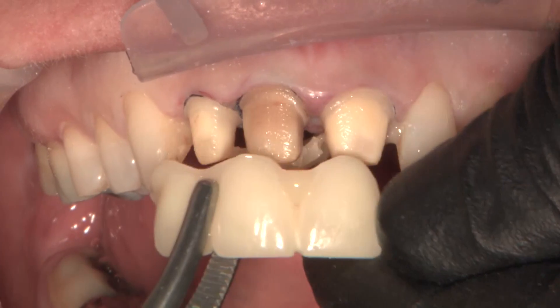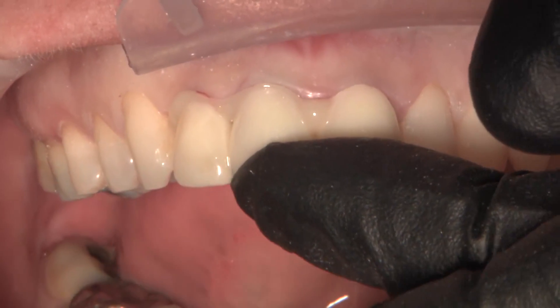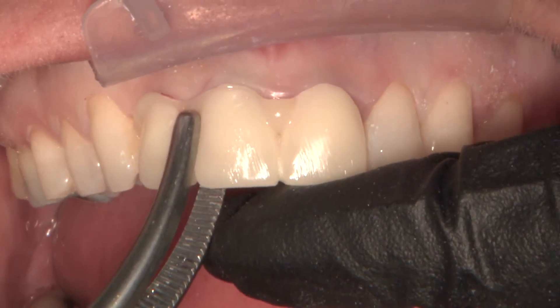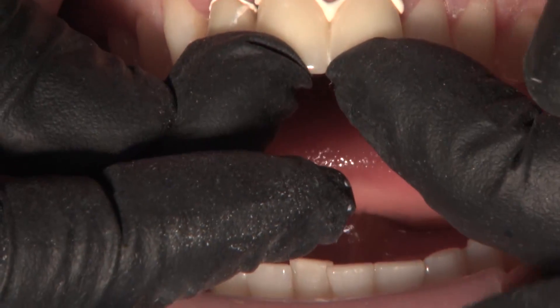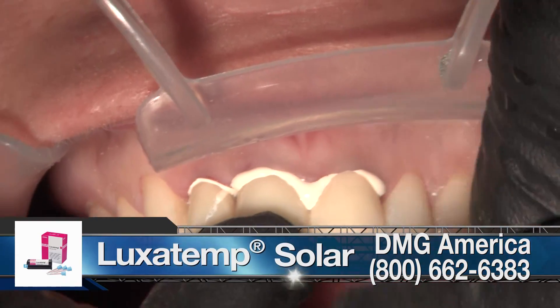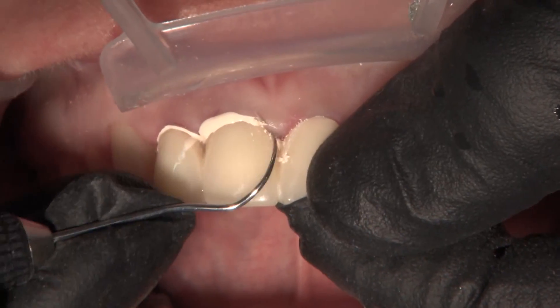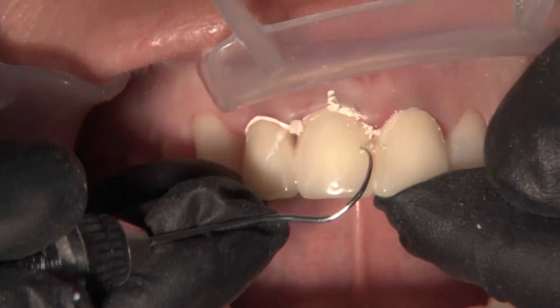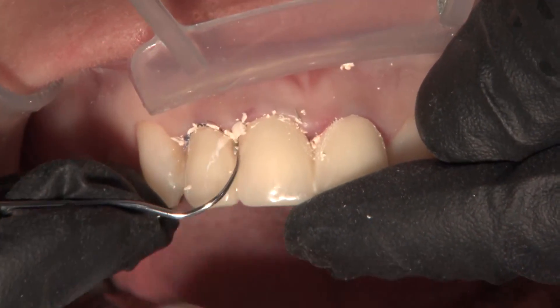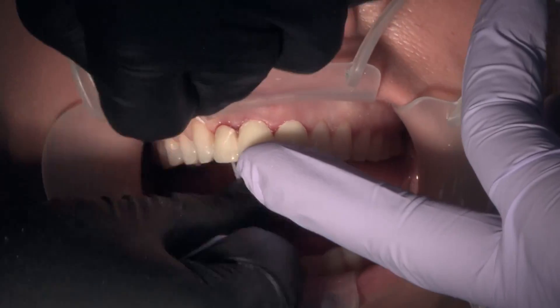You can reline biotemps with either a bisacryl material, methyl methacrylate, or ethyl methacrylate. The bisacryl materials will not chemically bond to the biotemps themselves, but sometimes there's enough mechanical retention that they will stick in place. We're using Luxatemp Solar from DMG — a bisacryl material that gets to a putty stage in self-cure mode. When you've trimmed most of it and you're ready to set it up hard, you can light-cure it. So it kind of cures on demand.